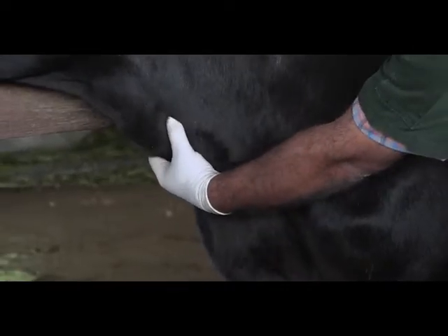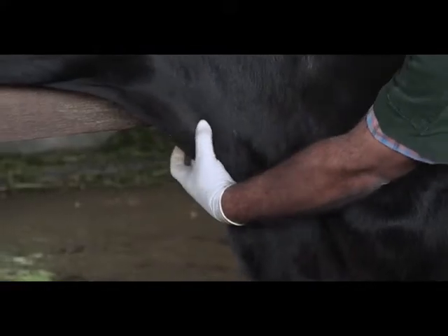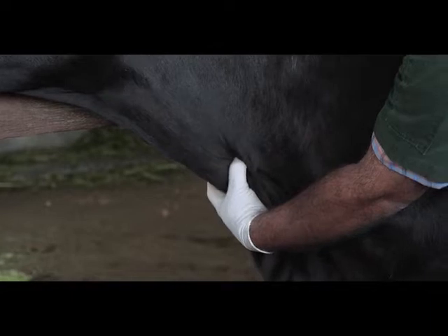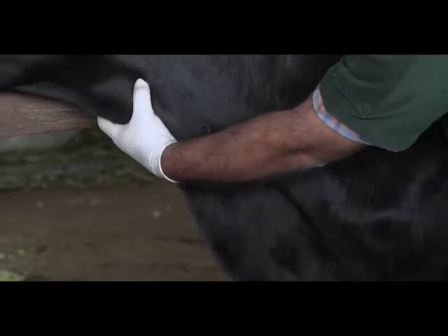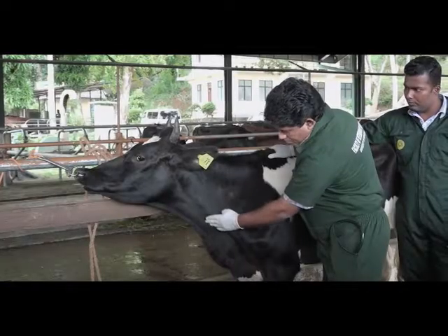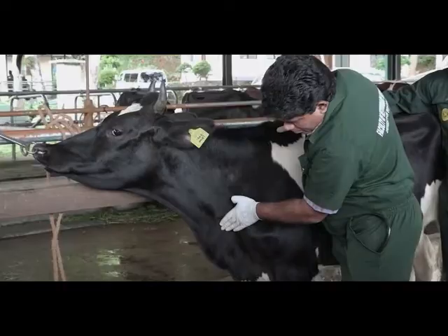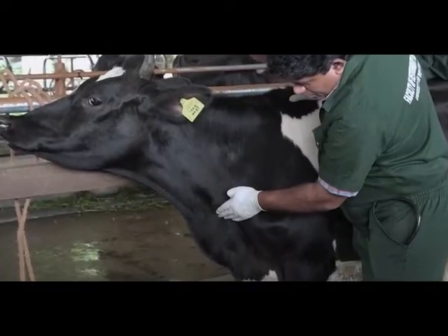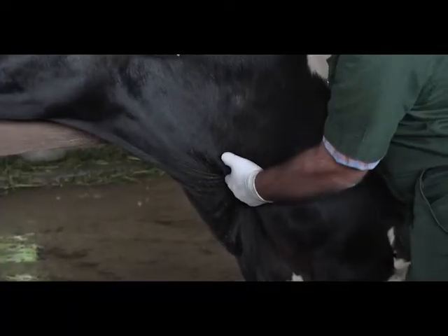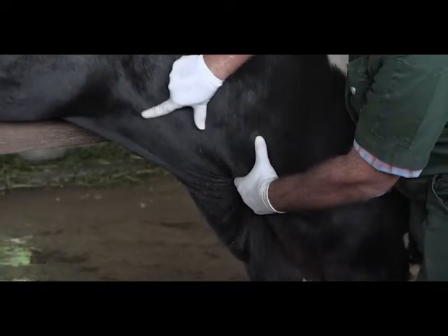Ventral to the jugular furrow, you can feel the trachea. You have to avoid the trachea when accessing the jugular vein, which is inside the jugular furrow. Now we are going to demonstrate to you how to arrest the jugular vein in order to access it. First, press the jugular furrow at the level of the thoracic inlet with your fingertips in order to allow the jugular vein to bulge out.